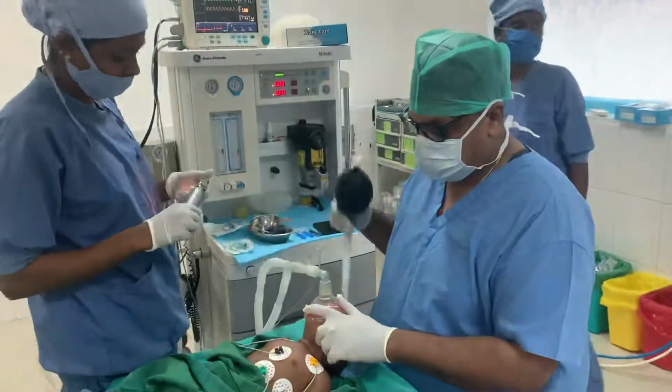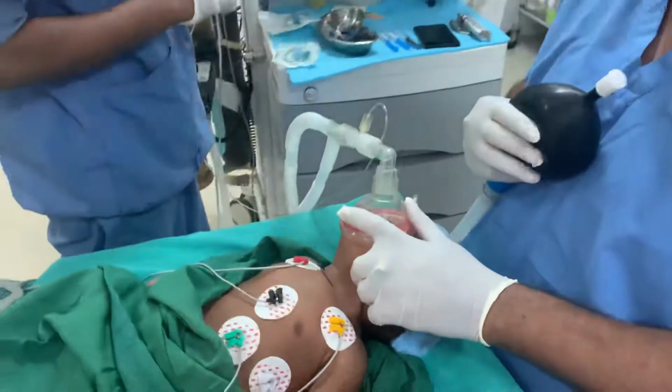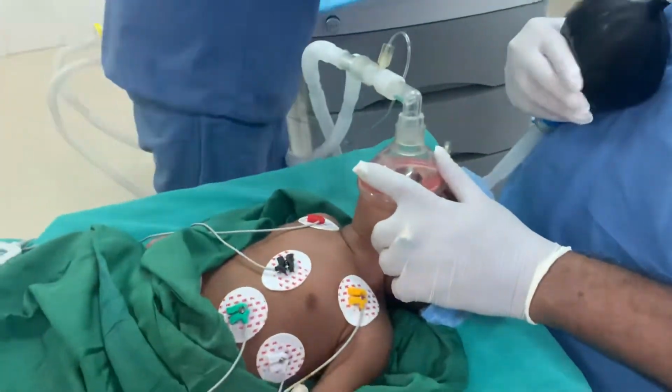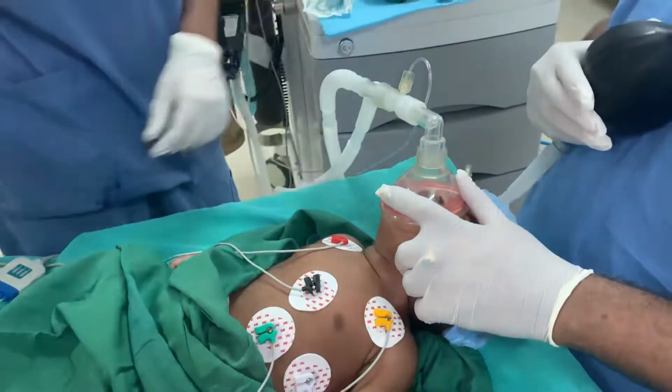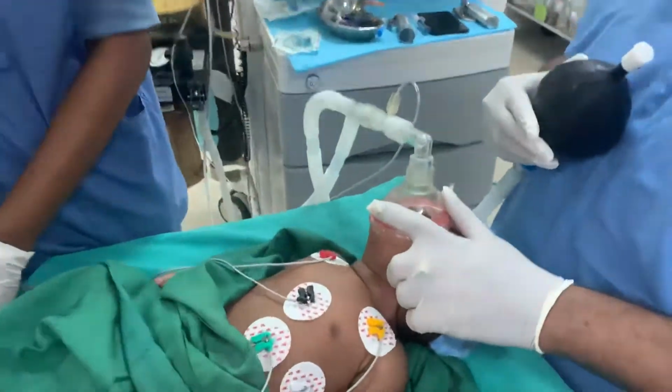So we're intubating a cleft baby here. This is a baby, about 3 months old, 5 kilos of weight, with a left-sided cleft lip and cleft palate. We're going to do the cleft lip repair today. Our pediatric anesthesiologist, Dr. Nishal, and his team are intubating this kid.